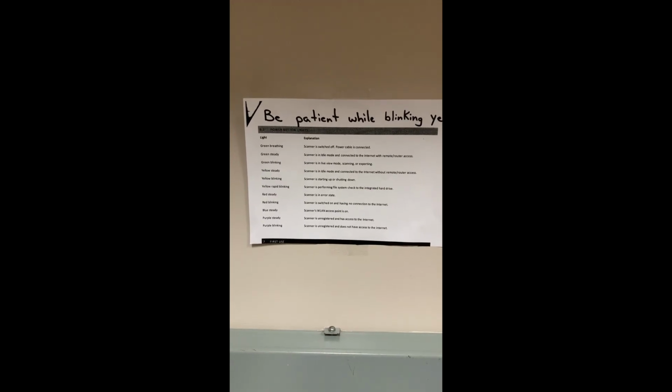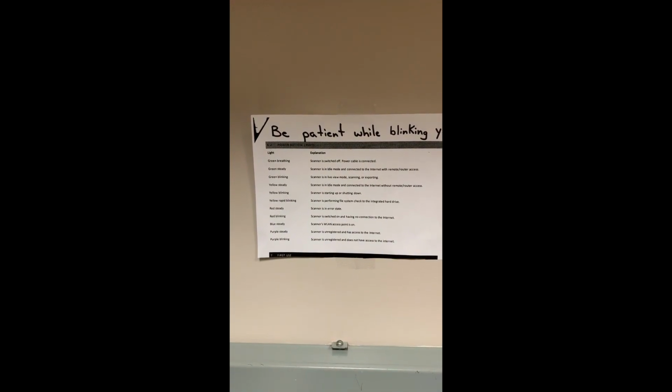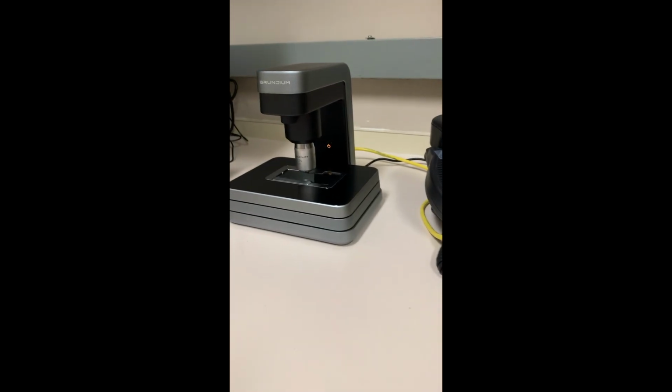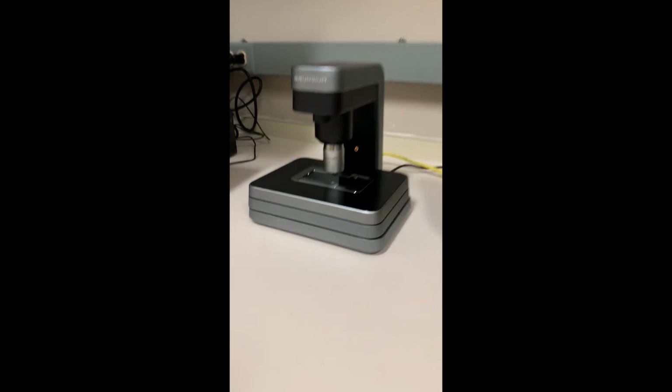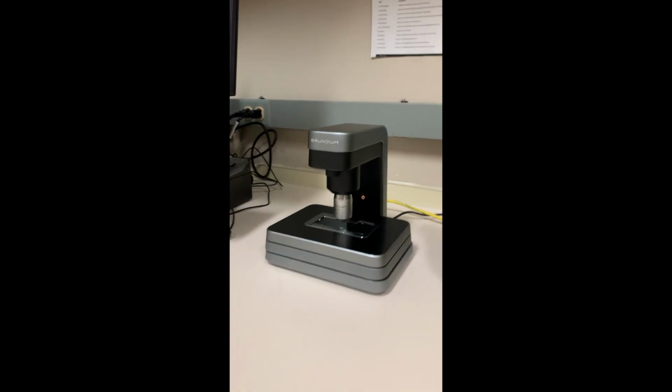If we go to what I've taped up here, solid yellow actually indicates that it is connected to the internet. And it's idling, so then it makes you think, why did you not connect? And what you need to know is that it has to be on the AHS network. I was actually on University Web Services and not on AHS, so that is why it doesn't connect.